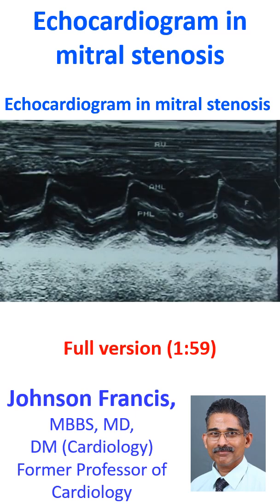M-mode echocardiogram showing the paradoxical anterior motion of the posterior mitral leaflet in diastole, with reduced separation of the two leaflets. The anterior mitral leaflet has certain points marked on its movement: C, D, E, and F.